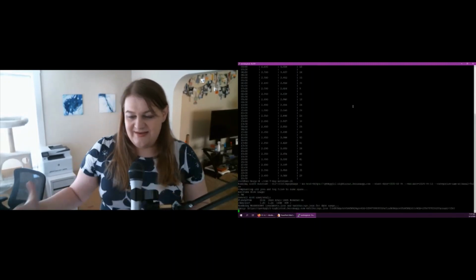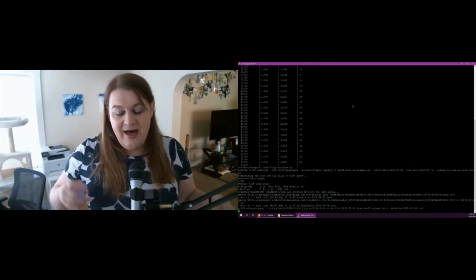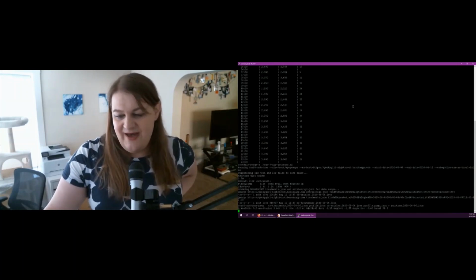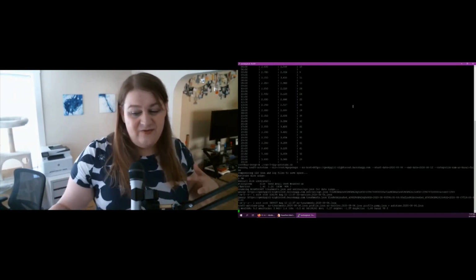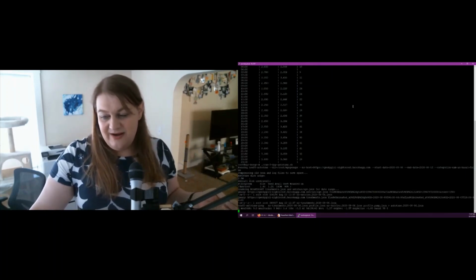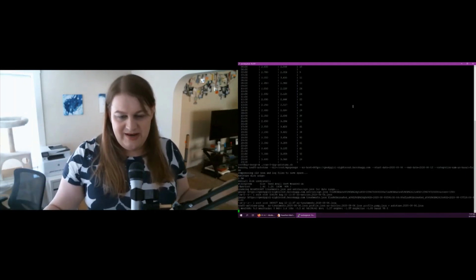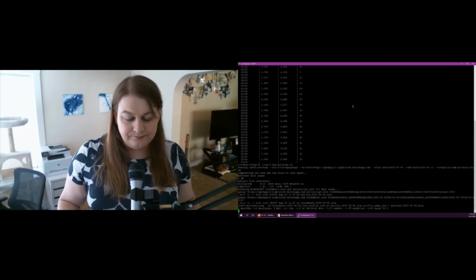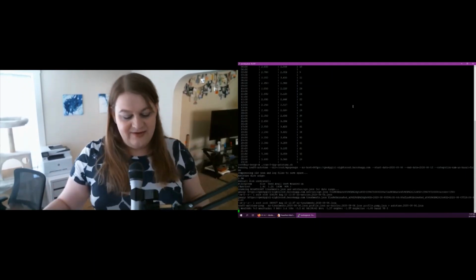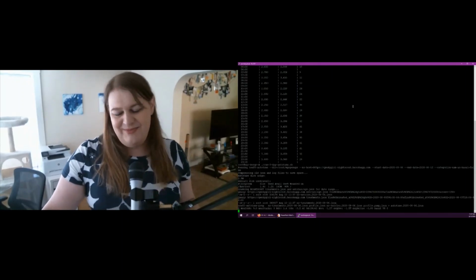So I can say, hey, right now, go out to the internet, grab those values from Nightscout and start doing some data crunching. So I can look at every 5 minutes, see what the deviation from what's expected is. And then say, this is the basal rate at the time. I need to adjust these. And then here in a couple minutes, it will spit out its adjusted basals for me. So it's a cool system. It kind of runs automatically. It's kind of trucking along slow. So I'm going to stop that for the moment.